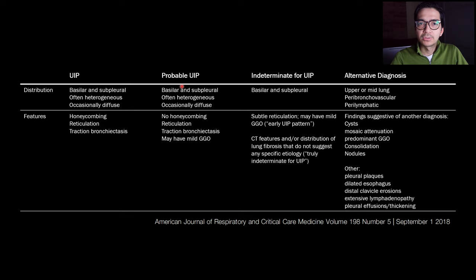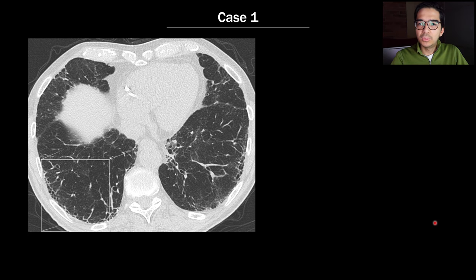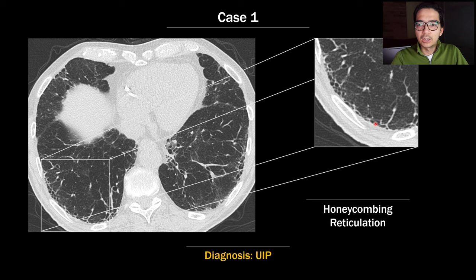Let's look at some examples. In the first case, axial and sagittal images show subpleural or peripheral predominant fibrosis that is basilar predominant on the sagittal. Zooming in, you can see cystic air spaces in the periphery of the lung — this is honeycombing with reticulation. So this patient has subpleural and basilar fibrosis with honeycombing, making the diagnosis UIP. Importantly, there are none of the alternative diagnosis features such as ground glass opacity, nodules, consolidation, or cysts.